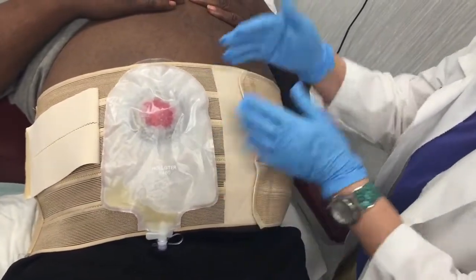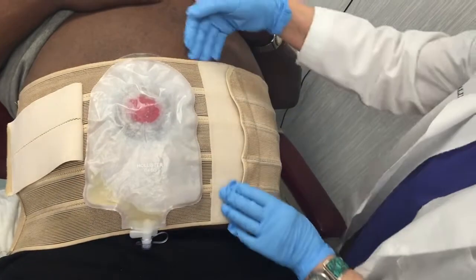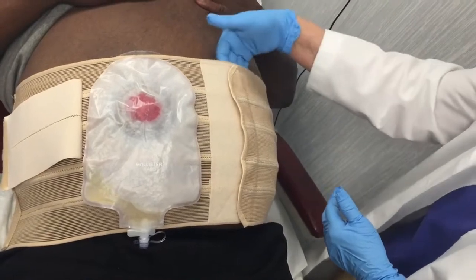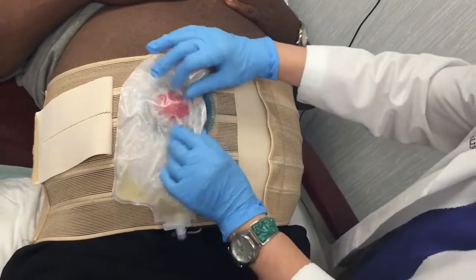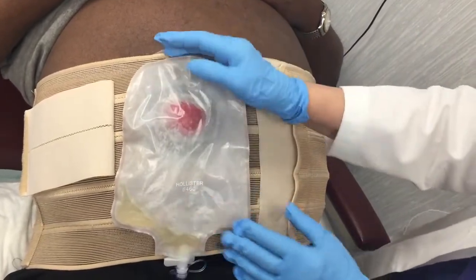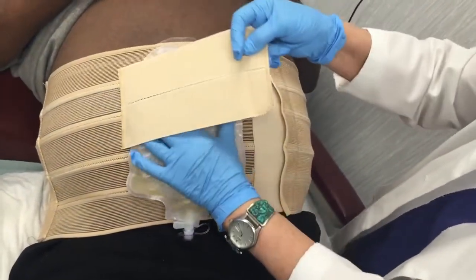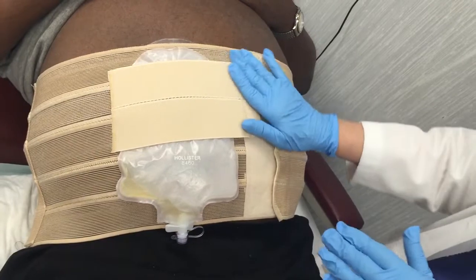He's been lying down and his hernia has been reduced, and we've placed the belt with him lying down. You put the belt so that it's comfortably snug — you should be able to slide your fingers underneath there easily, but it's still giving him pretty good support. His pouch is a very flexible, trim-to-fit kind, so he could bulge through. What I've added is a prolapse over-belt, which will give a little extra support over that area.